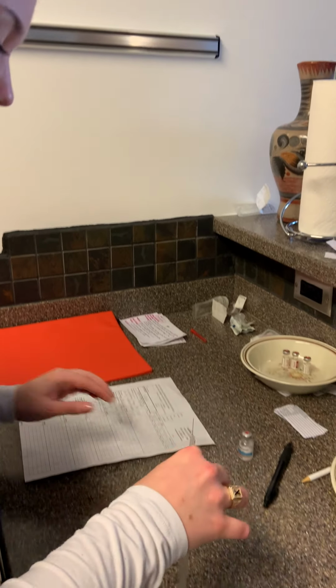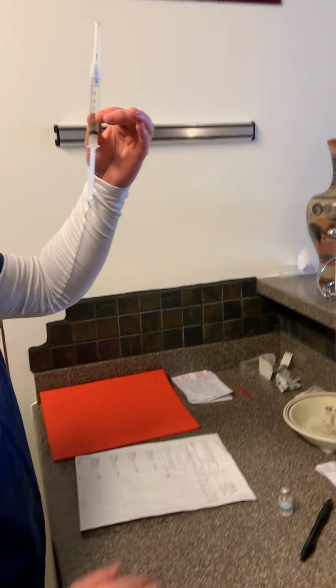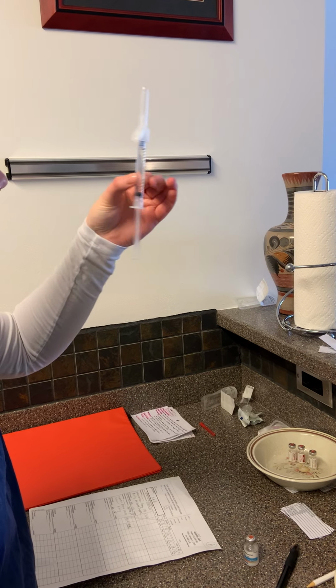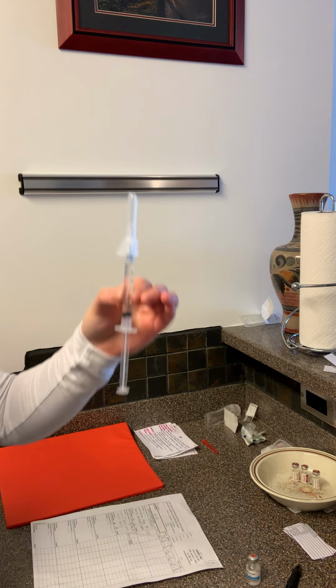Just going to recap it. Going to make sure I have no bubbles here and making sure that I have 3 milliliters. Okay.